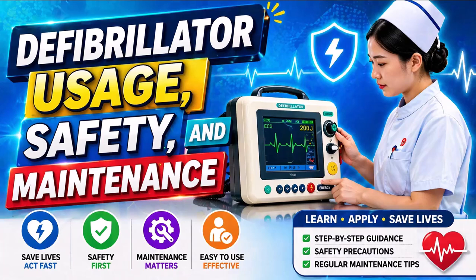13. Why is calibration necessary for defibrillators? A. To reduce alarm sounds. B. To improve cosmetic appearance. C. To maintain accuracy over time. D. To shorten charging duration.